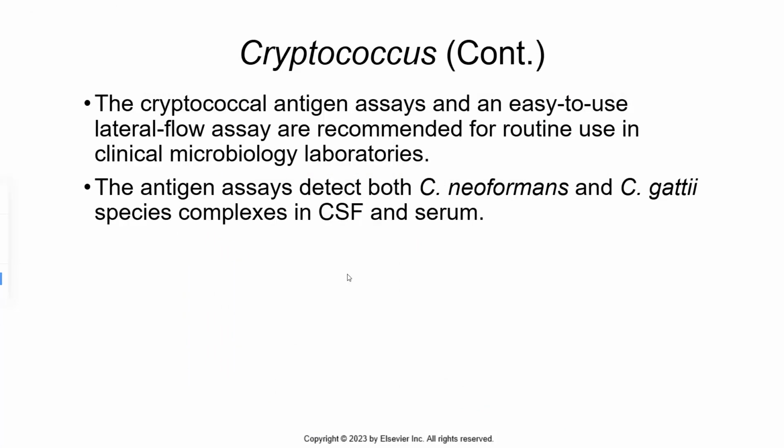The cryptococcal antigen assays, an easy-to-use lateral flow assay, are recommended for routine use in the clinical microbiology lab. Antigen assays detect both C. neoformans and C. gattii species complexes in CSF and serum.